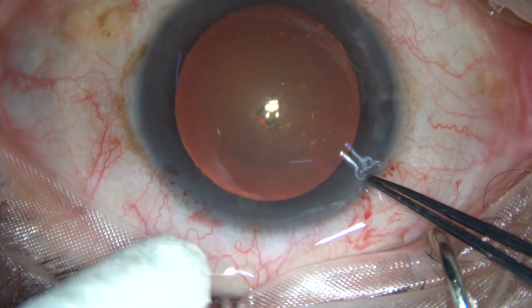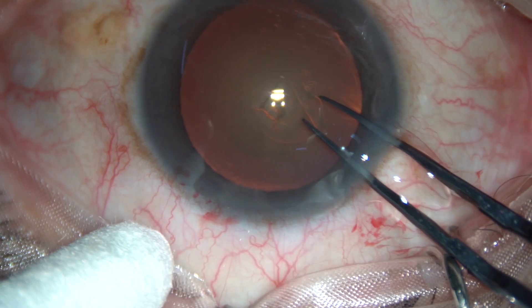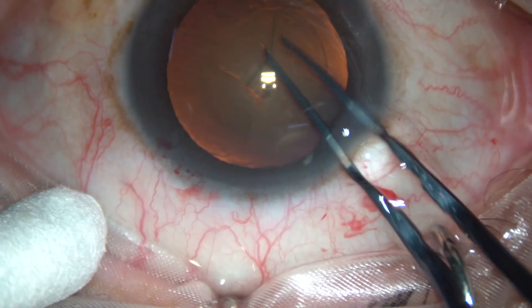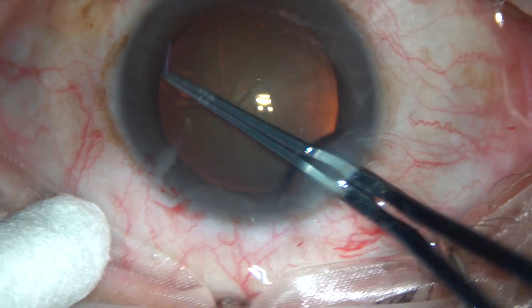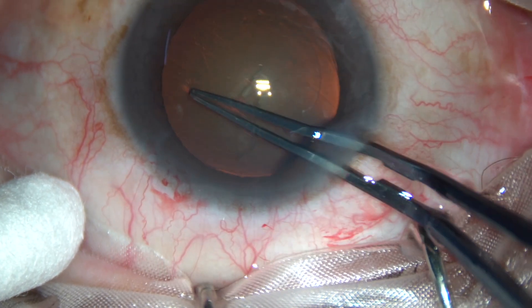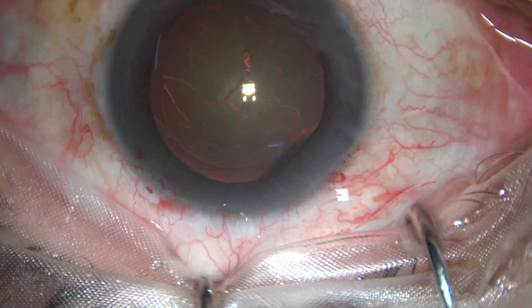Now I take utata forceps, keep an upward thrust at the anterior lip of the main incision, and thus I do this continuous curvilinear capsulorhexis. That's it.